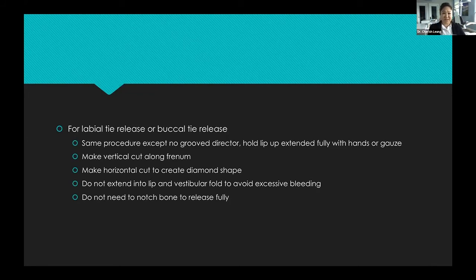So what happens if your kid is bleeding excessively anyways? Well, what I usually recommend is not to use silver nitrate, which some people use. The reason is because it stings really bad, and also it makes it all black after, so it's really kind of frightening looking. So use the tea bag method that we've learned throughout school. Soak that tea bag, let the tannic acids work and help that hemostasis and that clotting. That helps a lot. Or of course, pressure, if they'll let you.